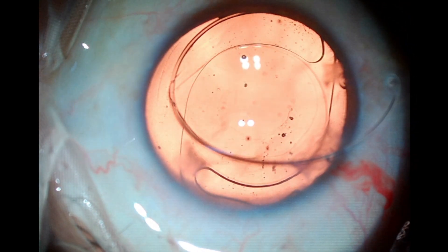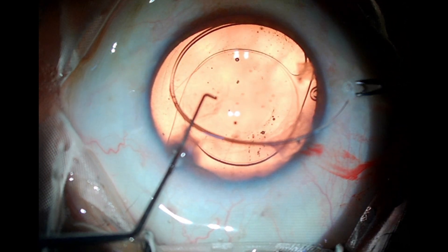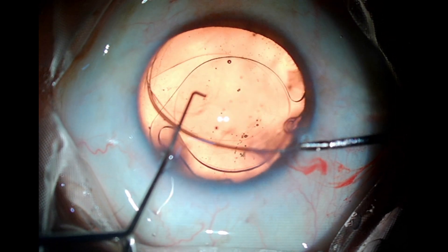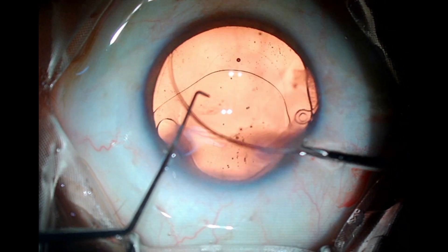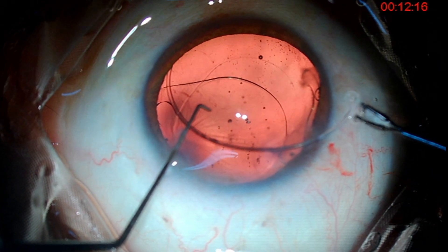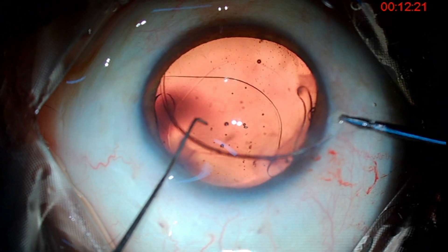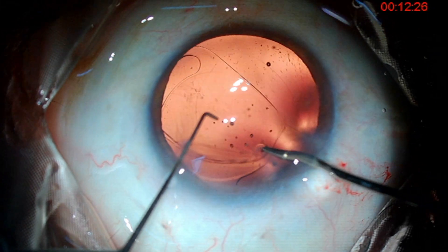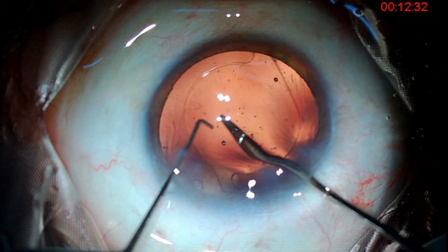I am going to use a forceps to insert the CTR in the bag. When inserting with forceps, you have to make sure that you first reach the same level of the bag. Here the mistake is that I am pushing the CTR much anterior to the bag and that's why the CTR jumped out of the bag — that should be avoided. Now I am doing it better by using forceps: immediately as I go in the anterior chamber, I will first push the CTR down to the level of the bag and then insert it to avoid the CTR jumping out.